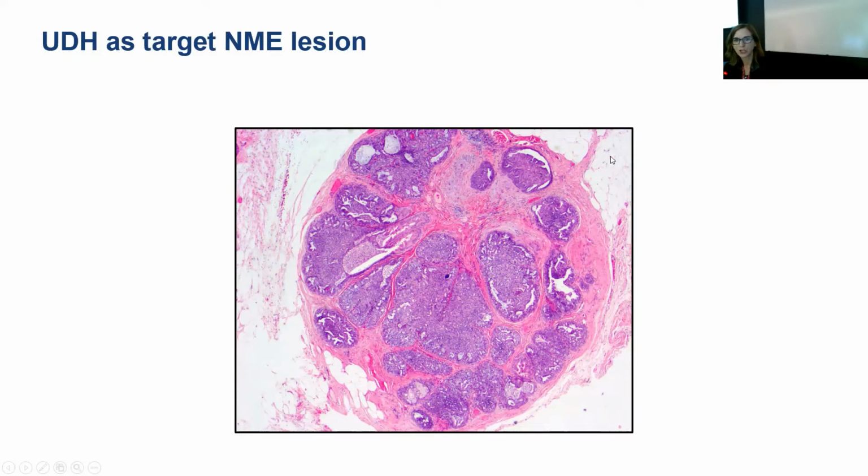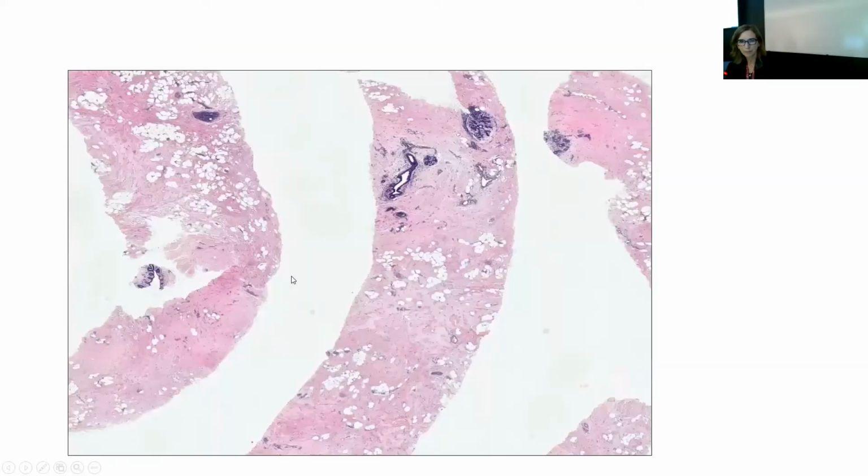You can well imagine how it stands out from the background adipose tissue. And so again, thinking about what the radiologic correlation could be. And as I said, the level of detection of lesions by our radiology colleagues now is such that they're finding minute lesions and sometimes biopsying them.